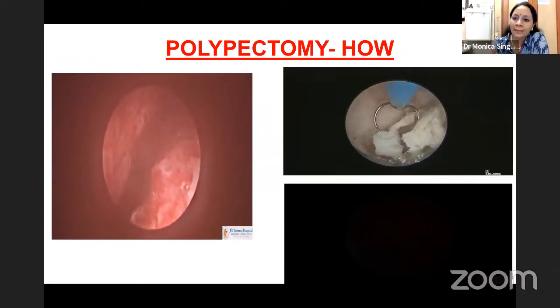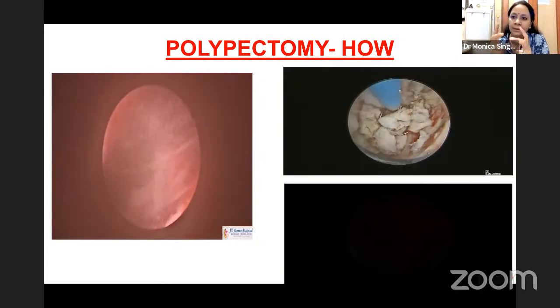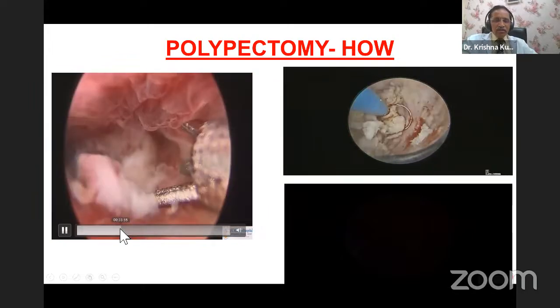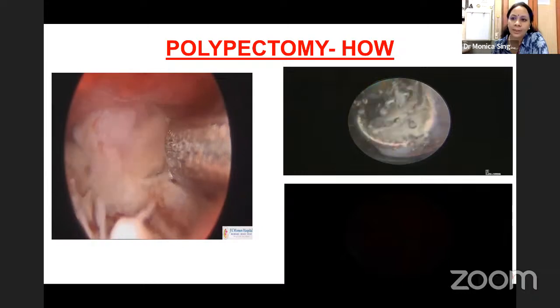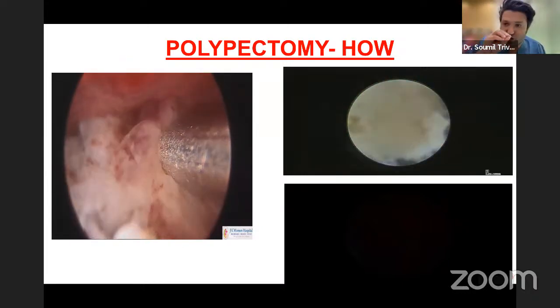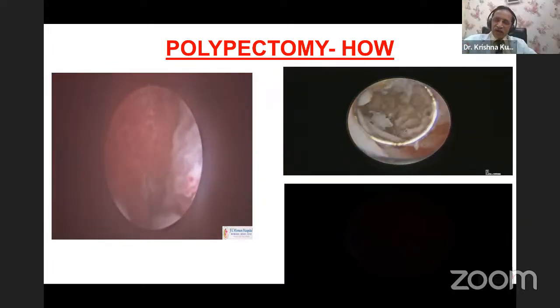I bought a tripod grasper from a conference. It's got three pods, the same thing which I showed you here. So this is the tripod. Can you see the tripod here? Yes. Madam, for a polyp extending beyond the internal os capacity, even the tripod grasper will just come out and slip, leaving the polyp inside.